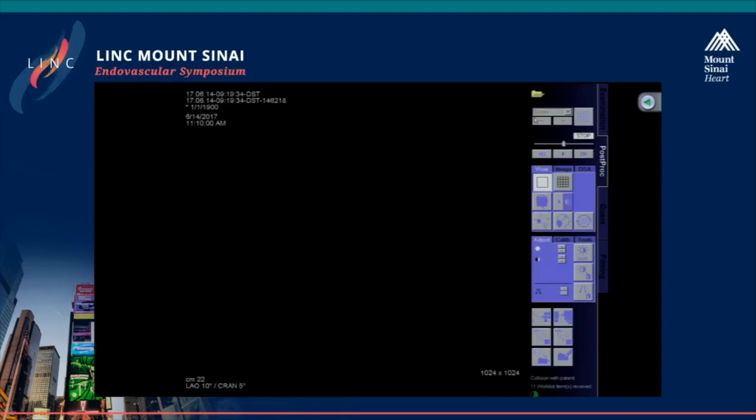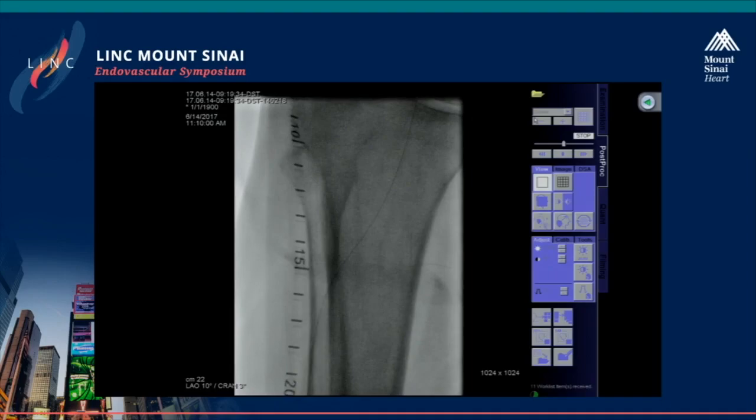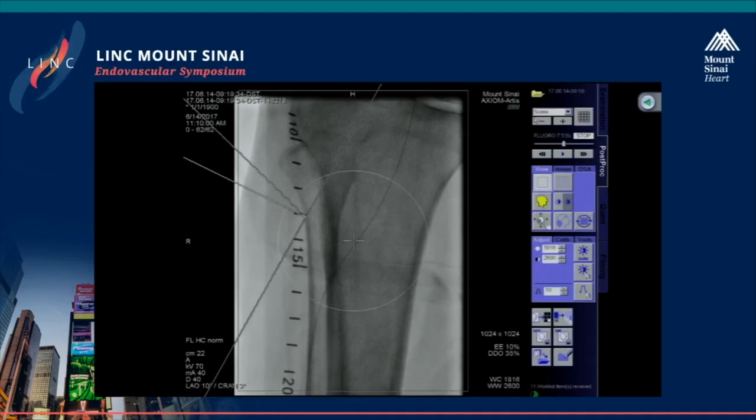Give me a 3.5 regular. Perhaps we could have a look at the foot to make sure that she's not having pain from embolism, just to make sure. Well, she's having pain in the foot, and I think she's been having pain before we started. Okay. So therefore, I think this is just part of what she's going through.